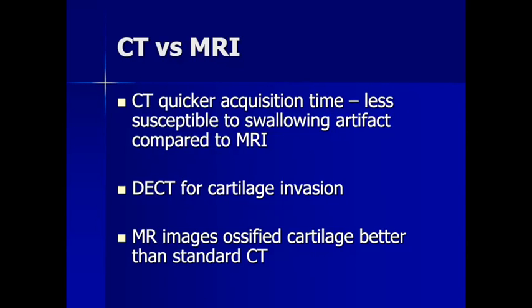Many people ask me, what would you use for imaging? Would you use CT or MRI when it comes to the larynx? Usually I'm not partial to any imaging, but I am definitely partial to CT for the larynx, because patients cough, clear their throat, and swallow during scanning, and MRI a lot of times will be non-diagnostic. CT is super quick. You can scan the larynx from skull base to the carina in less than 60 seconds, and you can easily see all that you need to see.